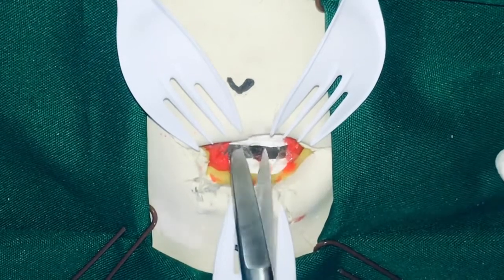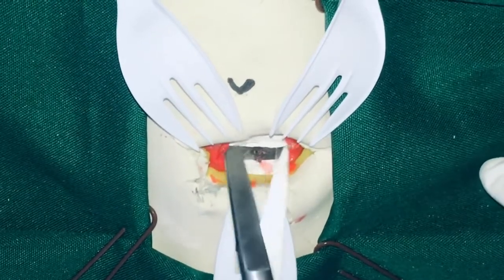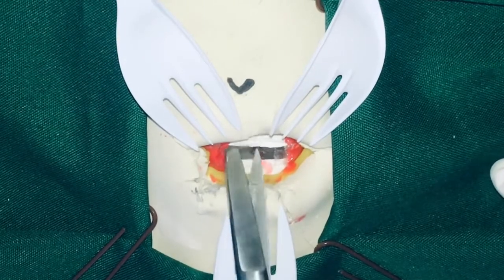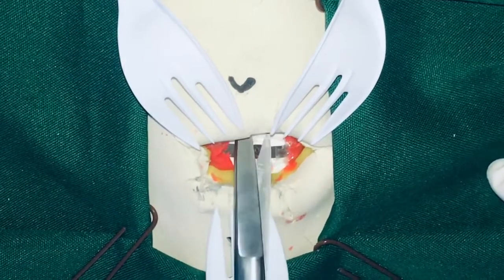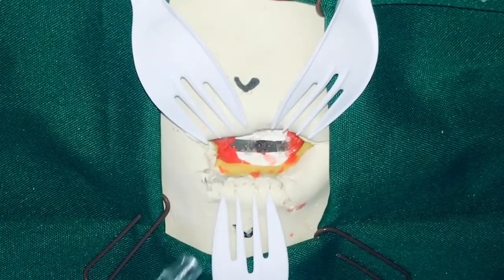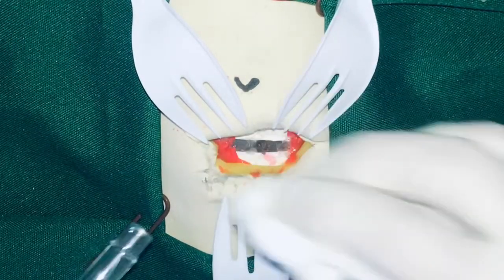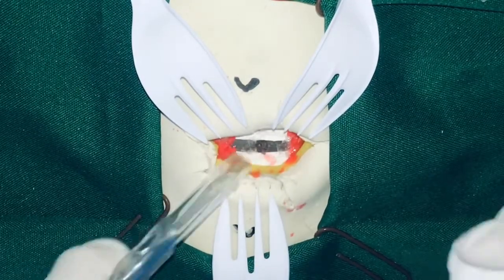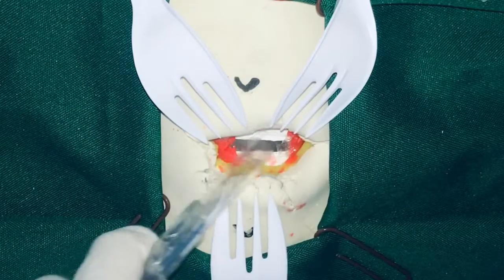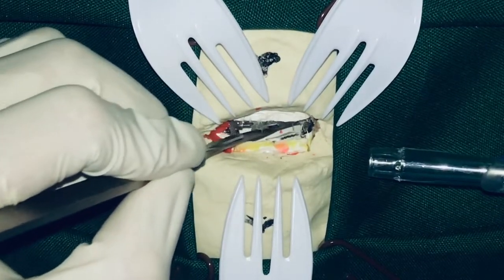Once the airway is identified, communicate with the anesthesia provider to confirm the safe FiO2 level. At this point, deflate the cuff and advance the tube and reinflate to avoid puncture of the endotracheal tube. Also, ensure that the surgical field is completely dry before proceeding, as it is difficult to achieve hemostasis once the tracheostomy tube has been inserted. The tracheotomy is made between the second and third tracheal rings.